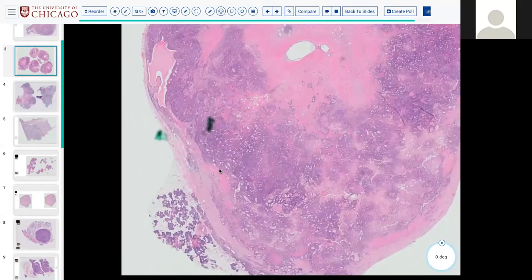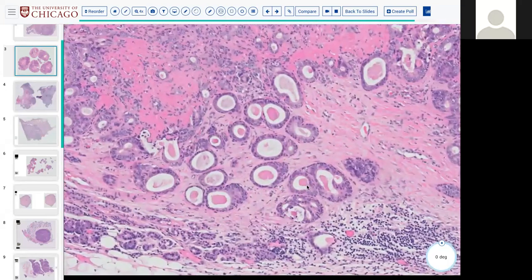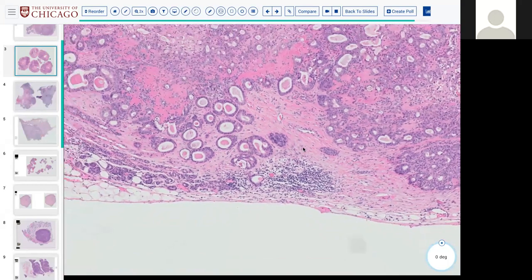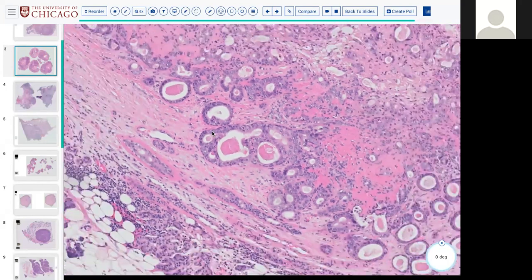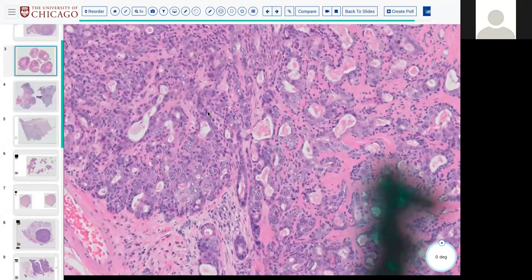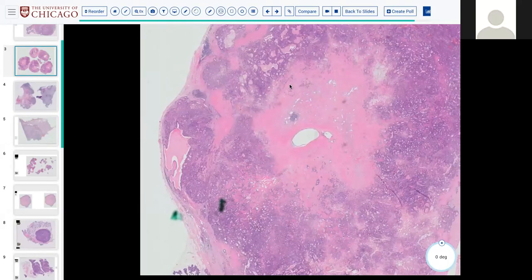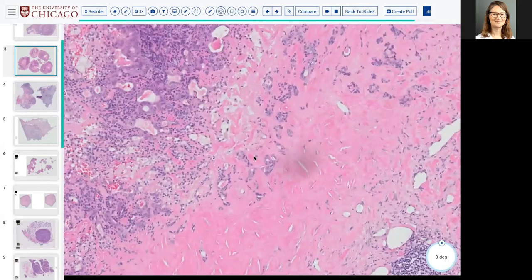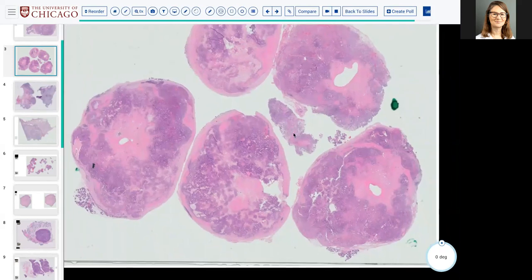I'm trying to see if we have benign PA here, because for me, those ducts are not benign. So maybe here, I believe it's malignant, but I'm trying to see if there is a benign PA component. Maybe I consider this hypocellular hyalinized nodule in the middle, maybe this is the PA. So I was thinking about carcinoma ex PA. That's what came to my mind.